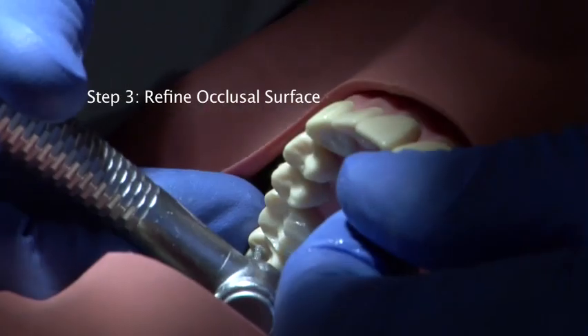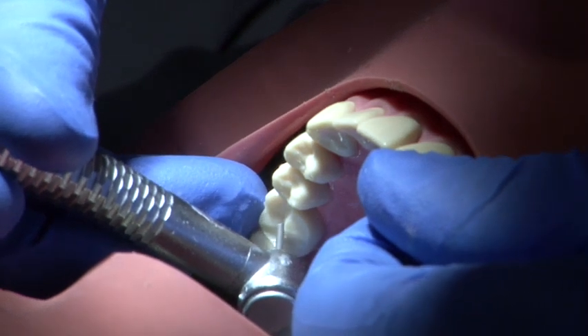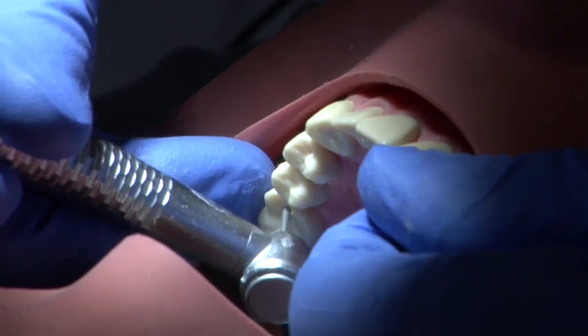After the occlusal reduction has been finished, the surfaces can be refined using a fine grit burr. Use a very light action to give a much smoother finish.